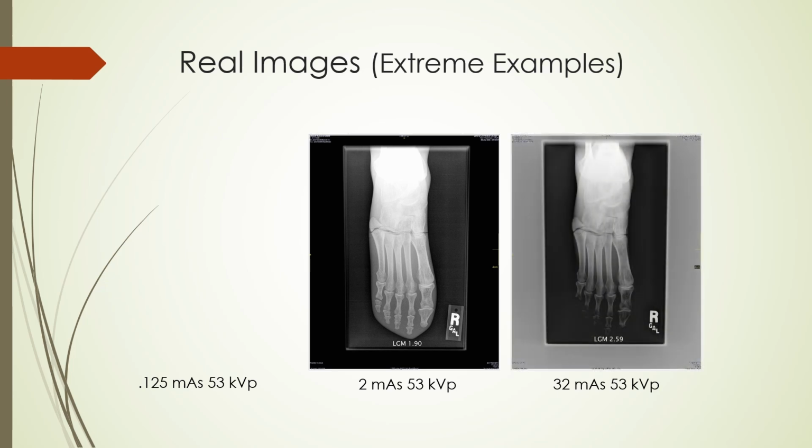For the right exposure, the mAs has been increased to the point where the computer cannot correct the excess radiation. If we try to correct the exposure manually using window width and level manipulation, it is no use. The overexposed pixels remain washed out and dark. To achieve this effect, the radiograph was overexposed by a factor of 16 times.